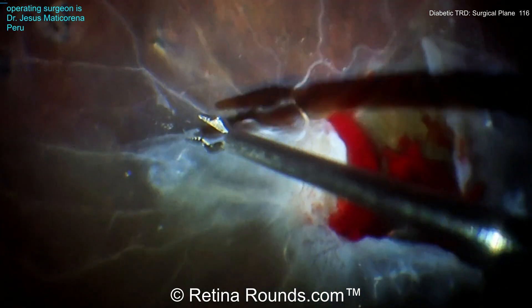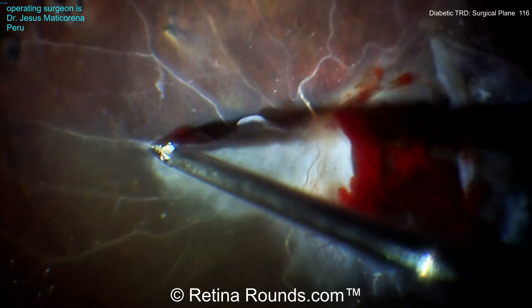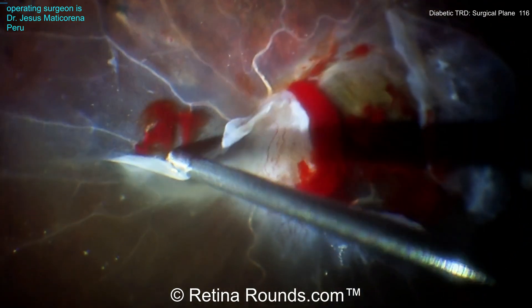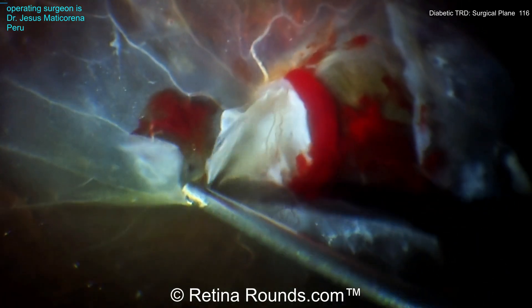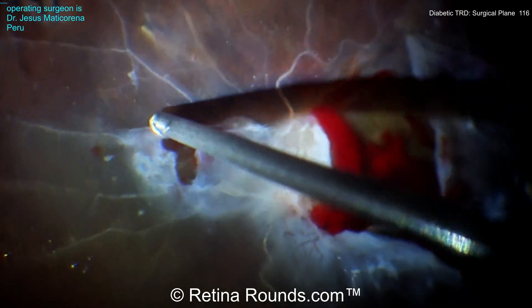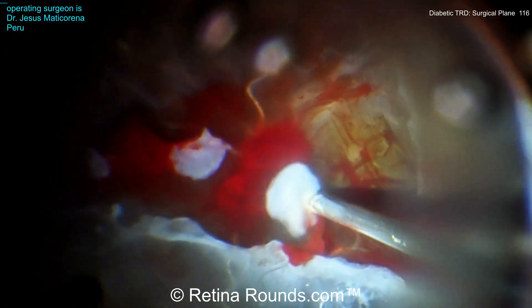On the nasal side, there's still some vitreous stuck to the underlying retina, and using the forceps he's gently elevating up that vitreous to access the correct surgical plane between the vitreous and the underlying retina. Now, trimming back some of these adhesions and segmenting some of these fibrovascular pegs.